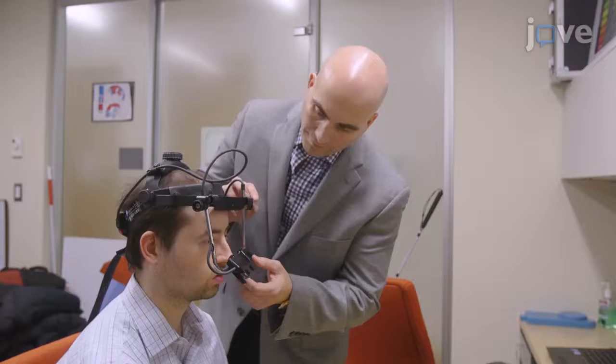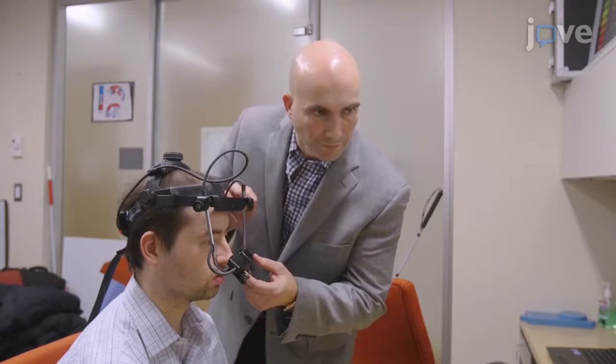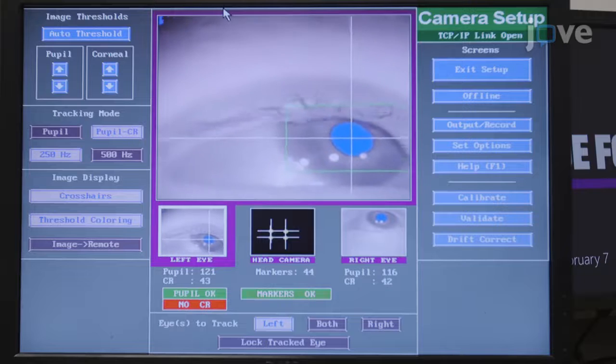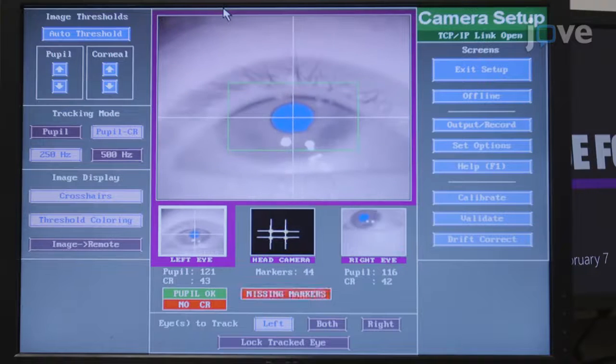Eye movements paint us a picture of cerebral function. However, studies focused on hand and limb motor function will very often leverage visual guidance as a core of the paradigm, but do not have a protocol in place for concurrent eye movement recordings. This method enables three-dimensional recordings of simultaneous eye-hand movements, which allow us to assess eye and hand impairment in visually guided saccade to reach tasks.